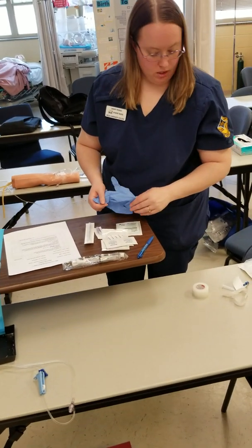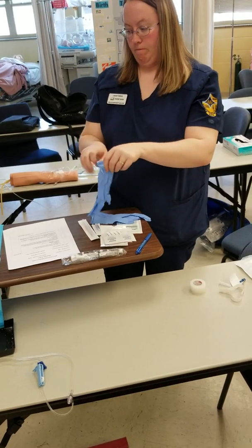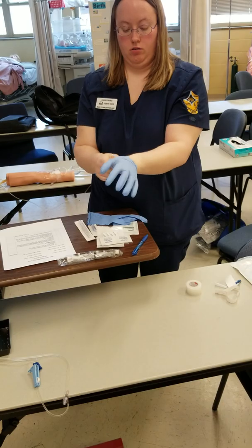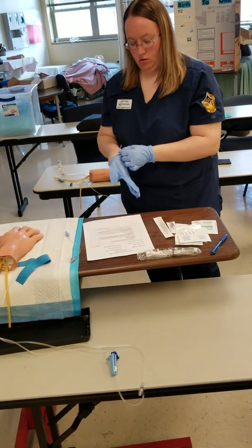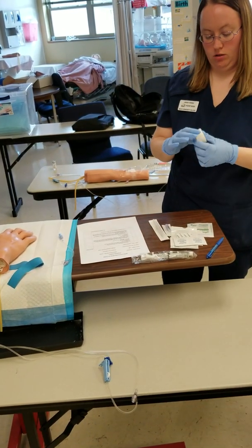I would then apply my gloves. And I would get my tape ready.